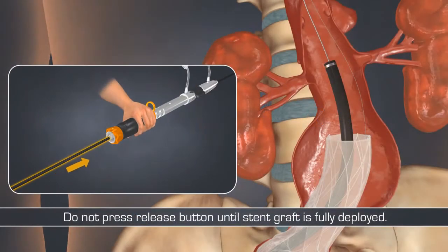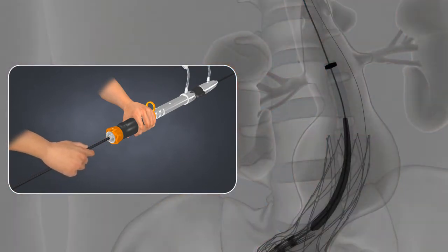Keeping the extension delivery system handle stationary, advance the inner core. This motion advances the stent graft through the introducer sheath.